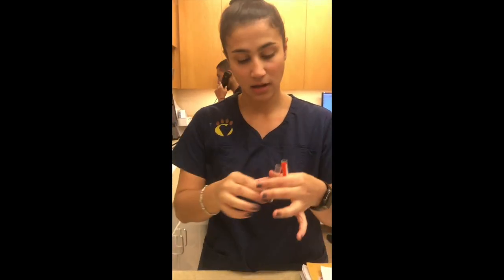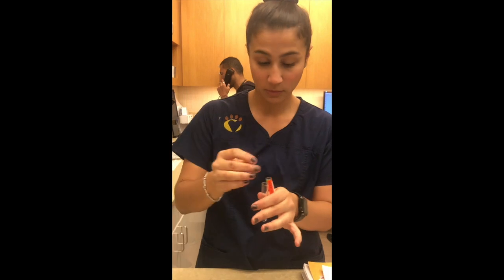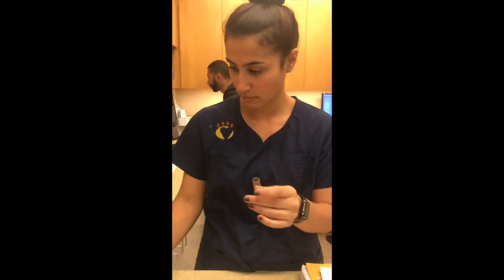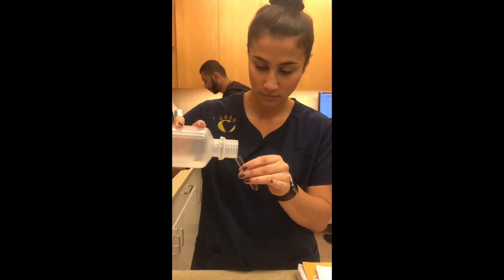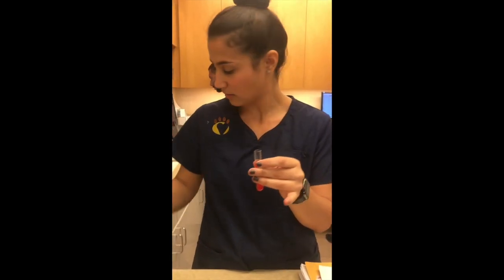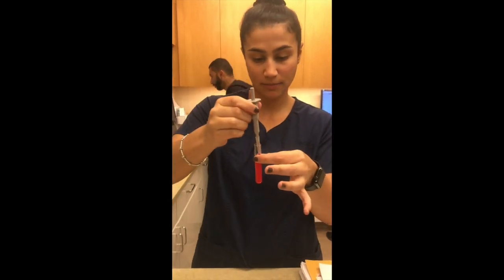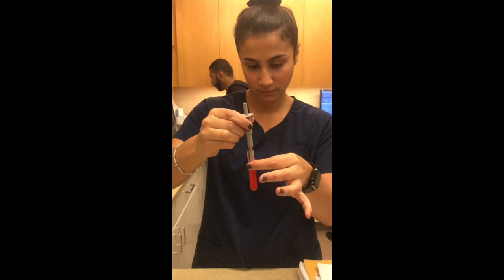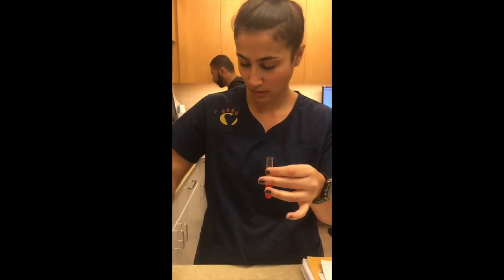Perfect. Now I will fill this tube up with saline as well. Perfect. And then just gently mixing it. Great.